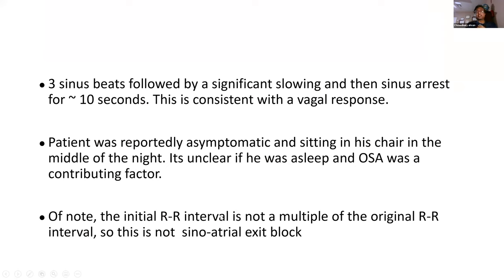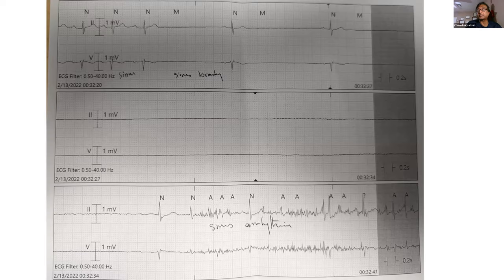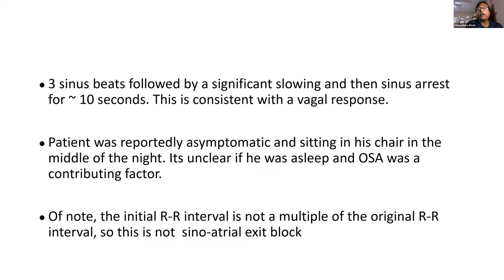So how do you differentiate sinoatrial exit block versus just sinus arrest? But your observation is clear, right? That you don't see any activities. So how long do you wait before you say this is significant and you need to have a pacemaker backup? This was almost like 10 seconds.